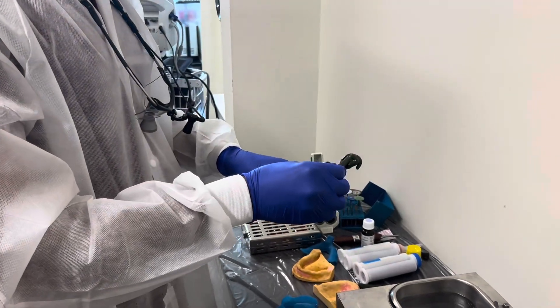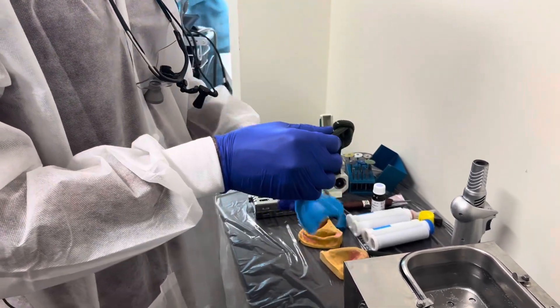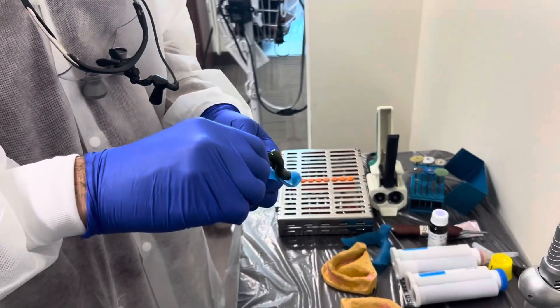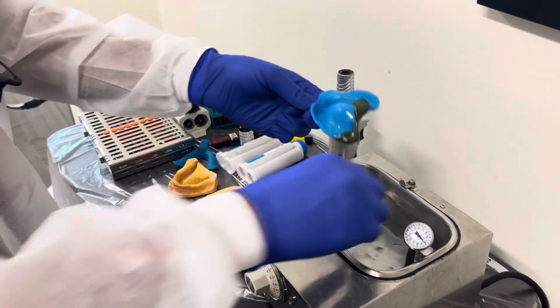That takes a little bit of practice. We're going to make sure it's a little softer. Once it's the right consistency, we're going to go ahead and transfer that onto the posterior border area of the tray. I'm not really critical of how it looks because I will be adjusting it using the hot water bath.